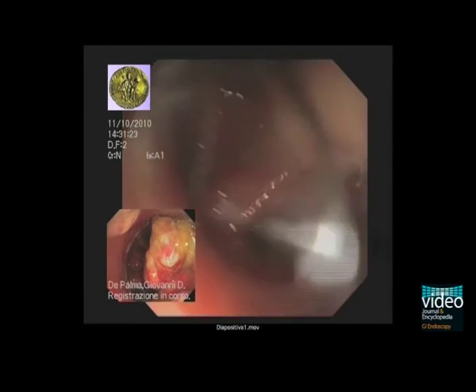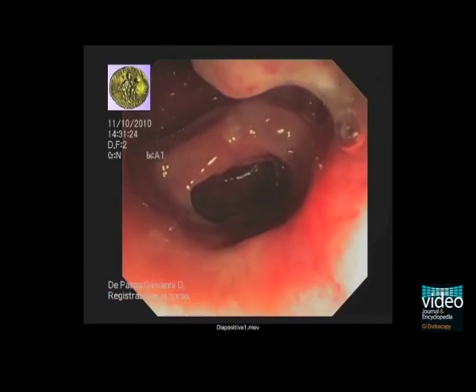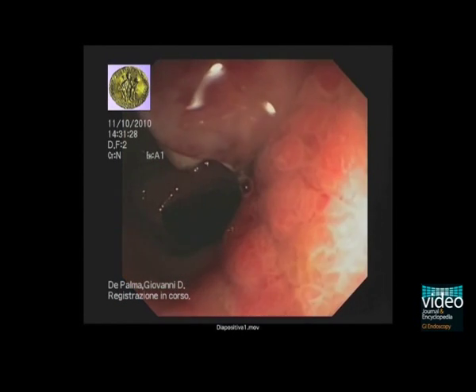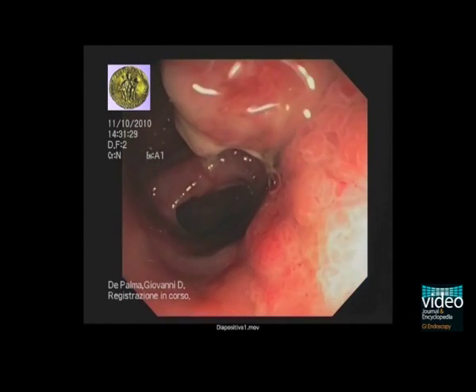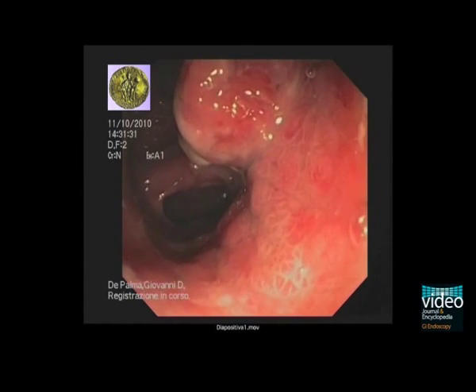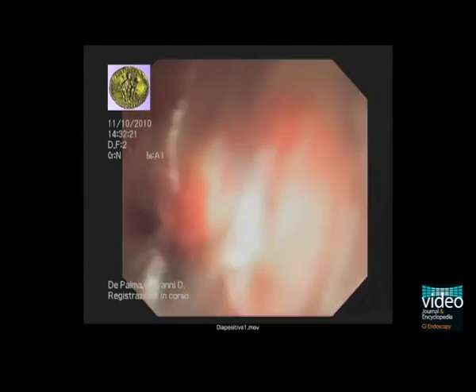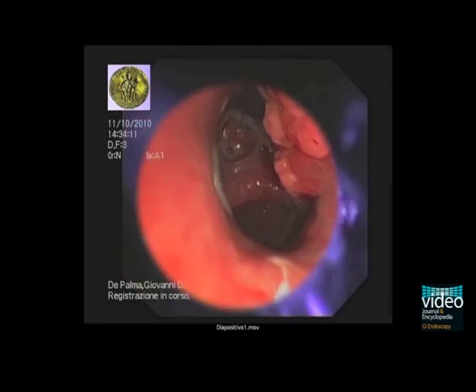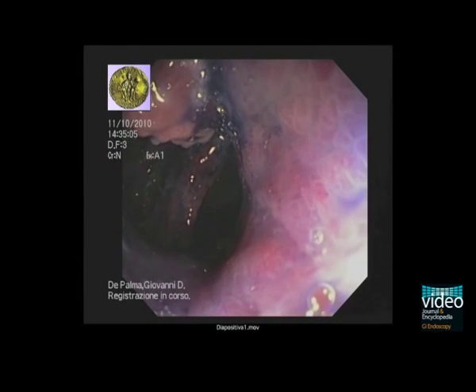Colonoscopy reveals many inflammatory polyps in the rectal stump and a polypoid mass at the level of the anastomotic ring. The lesion is stained with 1% methylene blue and carefully inspected together with the surrounding mucosa.